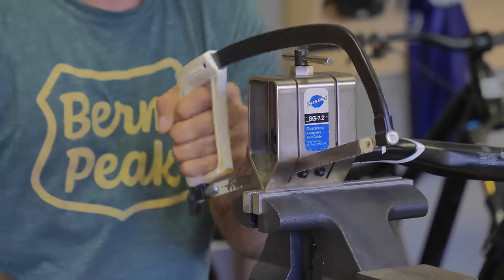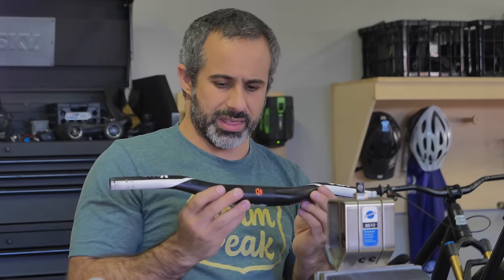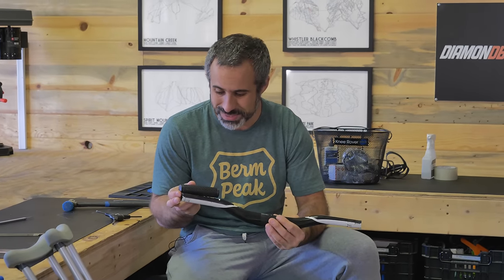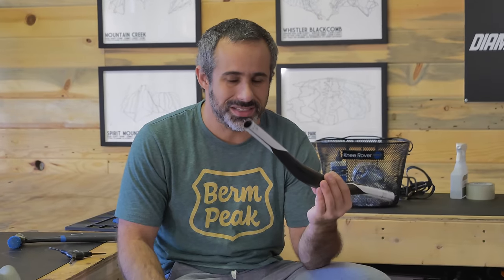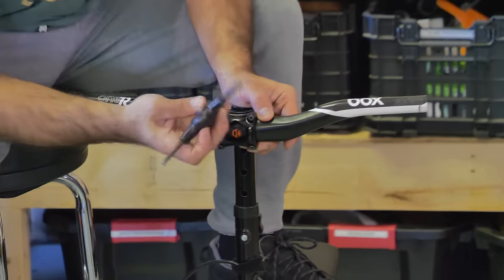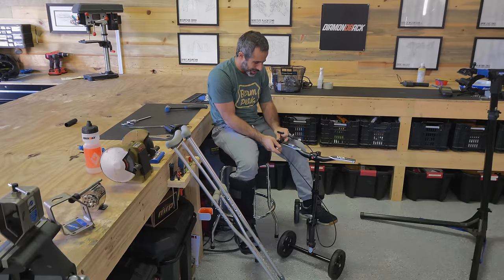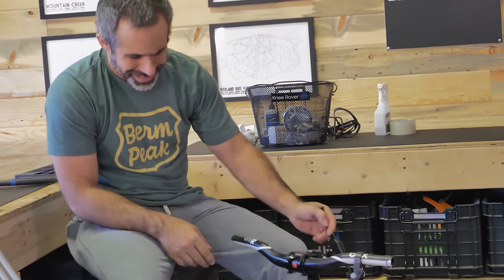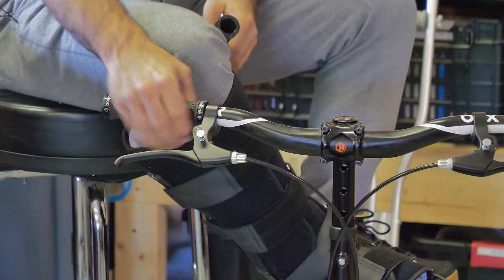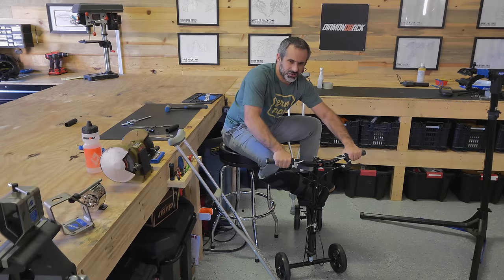We've got to put these handlebars on but first I've got to cut them down because they're way too wide — I'm not going to be able to get through doorways with these. These are so short that I don't know if I'm going to be able to get grips and levers on it, so I might have to put the lock-on grips on and have them kind of hang off the end a little bit. If I stick these lock-on grips on — they're a bit wider now but it'll still fit through a doorway. Yeah this feels good, let's run it. It's a freaking knee rover.